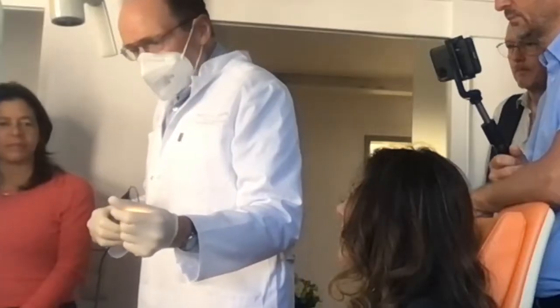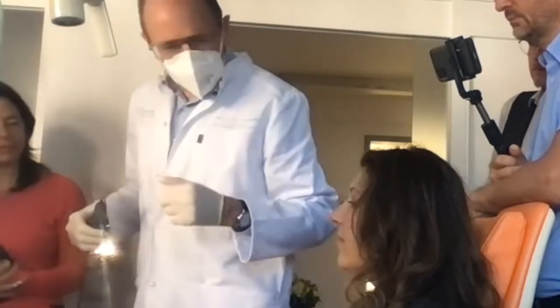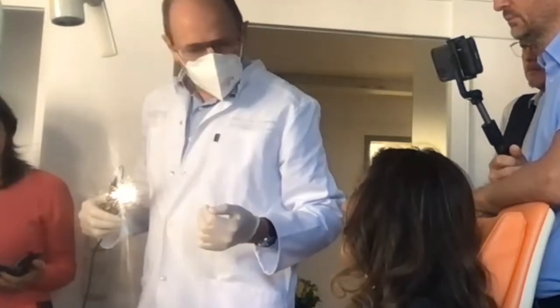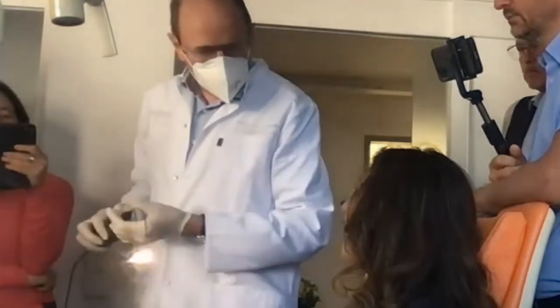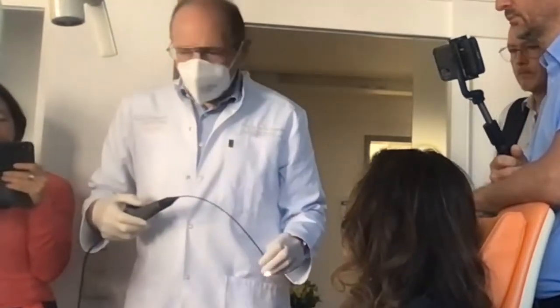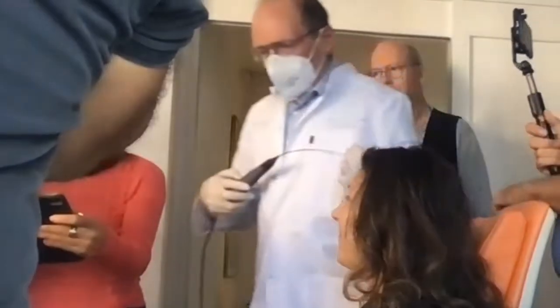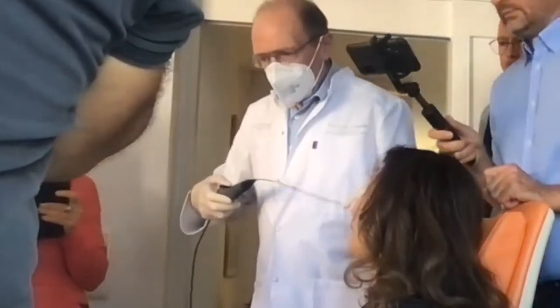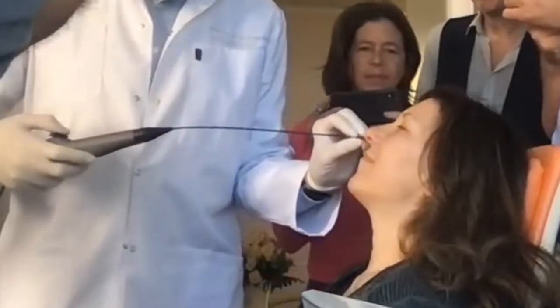I have to put a mask. You may take some anesthesia if you want to. There is some spray. Now, I usually do not use anesthesia, but if you feel some discomfort, you may use it. I prefer to check it just like this, and then we. Now you're on this side. Okay, please lean back. And then we may look at the.